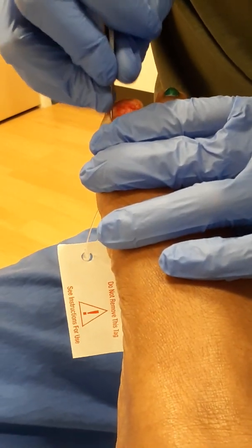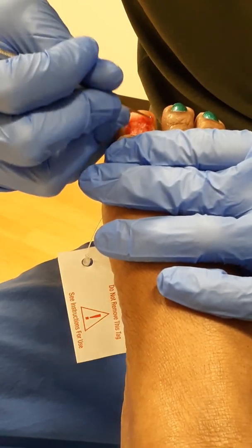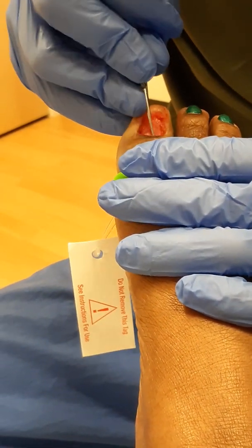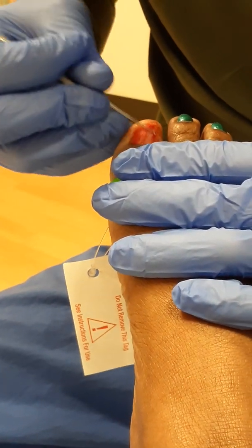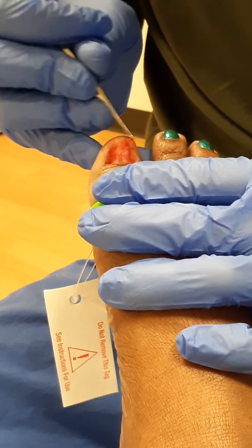So I'm just going to clean out some of these corners where sometimes some dead skin builds up with these ingrown nails. And then make sure we get the base of it nice and flat, so then when we kill it with this chemical, it stays killed.